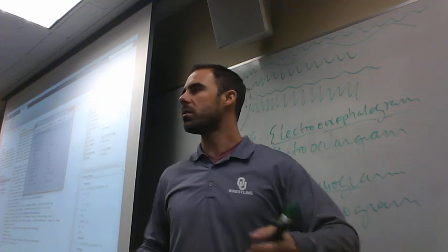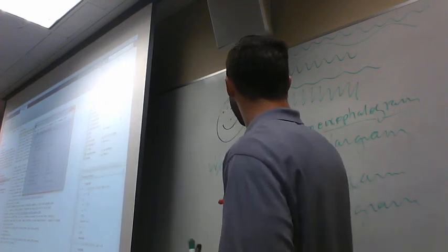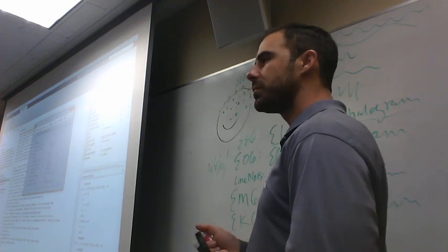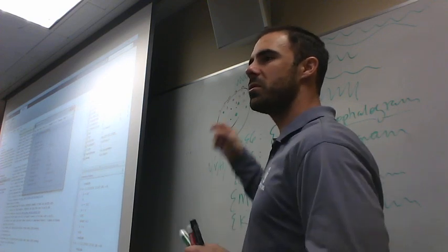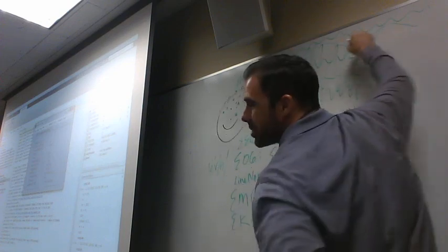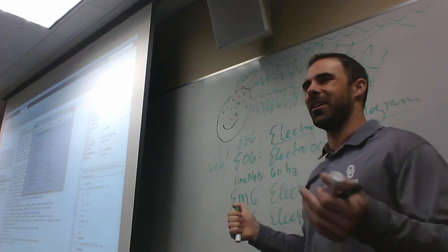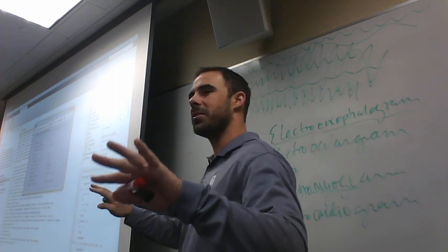So the idea here for this sort of mini lecture on these topics is we have all this stuff happening, and so instead of these nice clean signals, what we get is a singular signal for each of these electrode sites that just mushes it all together. That's fine. We're detecting all these things. We'll talk about ways that we can pull them apart to get cleaner signals.